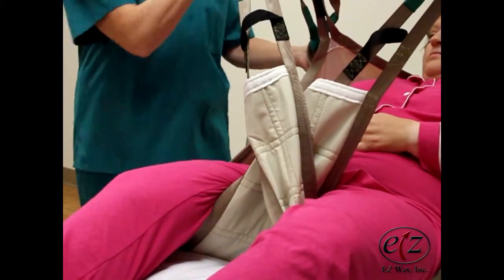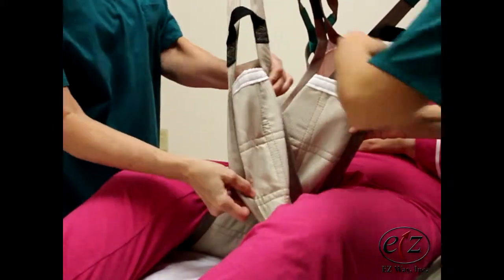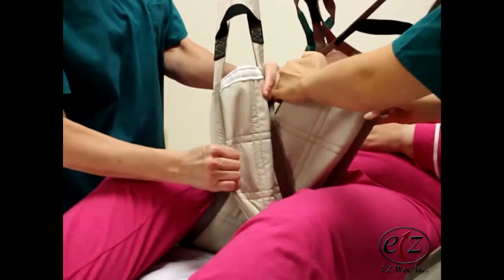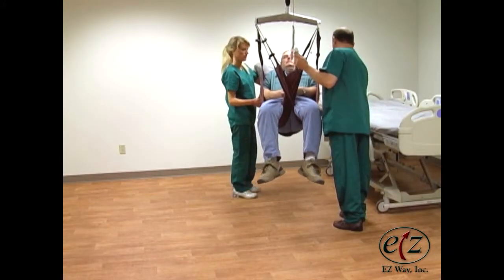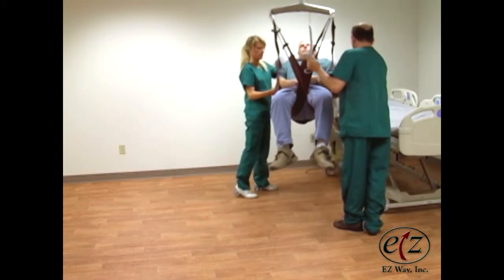If necessary, smooth sling legs under the patient's thighs with a slight tug on the outside seams of the sling legs. Lift the patient until they are high enough to clear the bed or chair they are being transferred to.